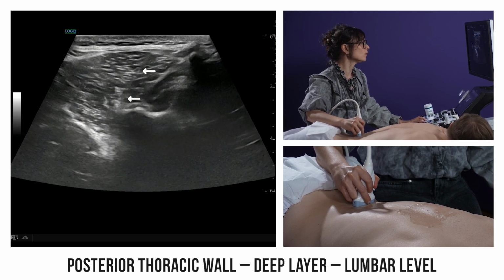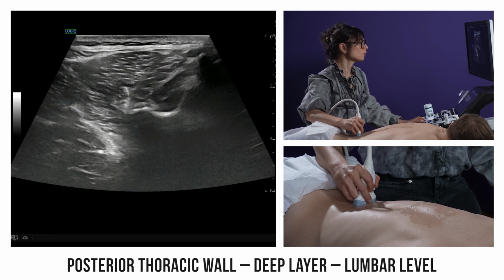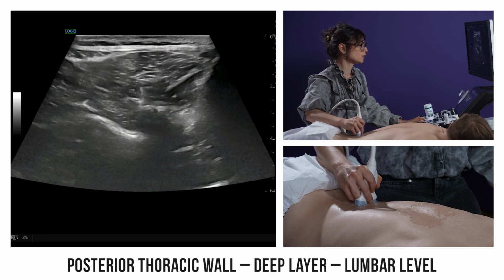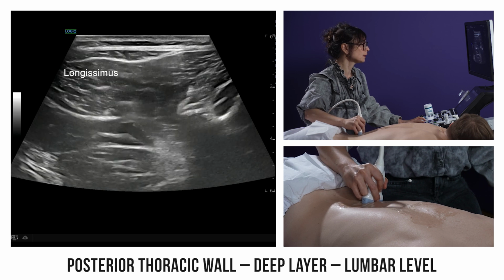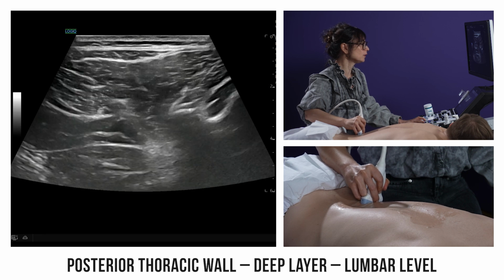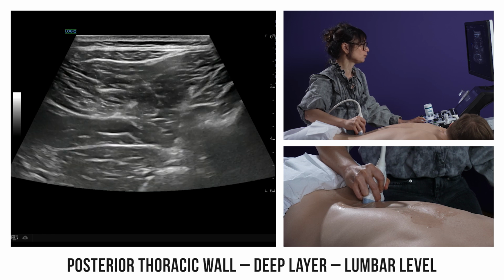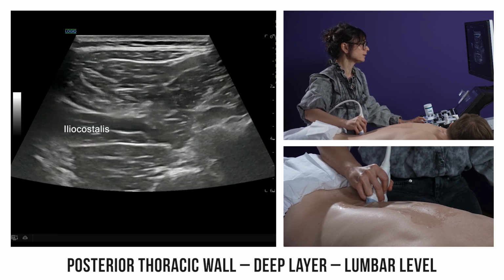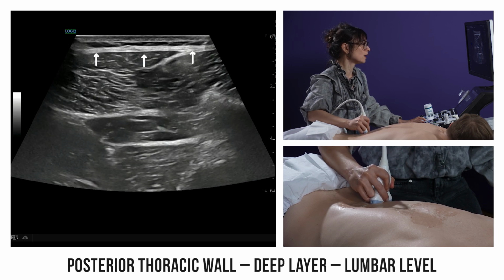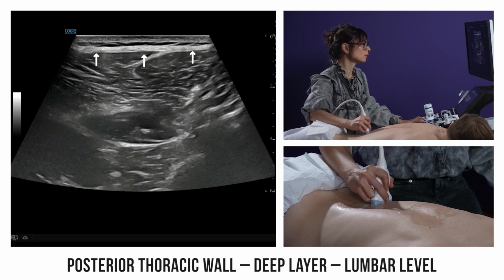Moving laterally, we observe a fatty plane that separates the multifidus from the erector spinae muscles. Immediately lateral to the multifidus lies the longissimus. More laterally, separated by an aponeurosis stemming from the erector spinae, we find the iliocostalis. Superficial to both muscles is a broad aponeurosis, which corresponds to both the erector spinae aponeurosis and the posterior layer of the thoracolumbar fascia.